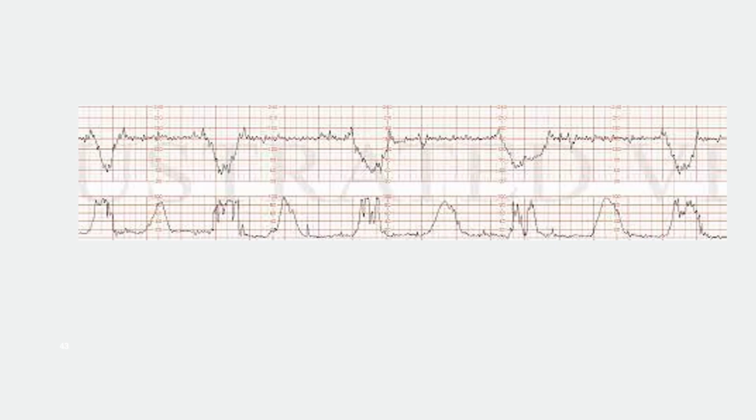We're weighing out, okay, how much more pushing does she have to do? Is the baby going to come out? This is a case where we may consider doing a vacuum if the head is low enough, but we weigh that out to see.